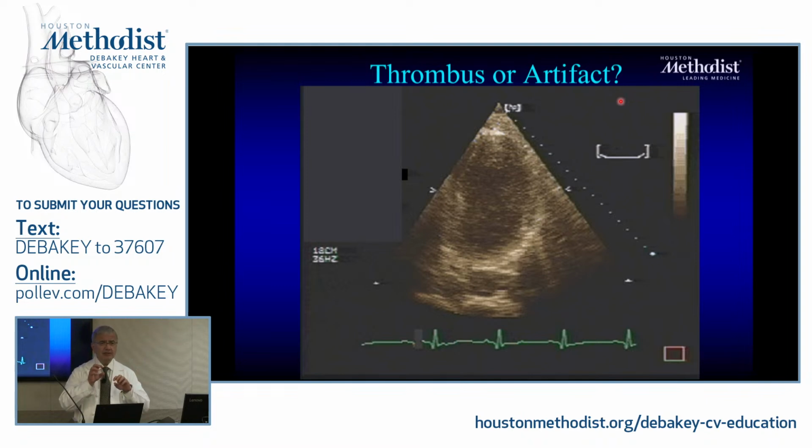So just imagine if some of these ultrasounds are being reflected from any of these structures and back again, and back again, back and back and back. You can construct images that are funny in a way and could be not as crisp and clean.